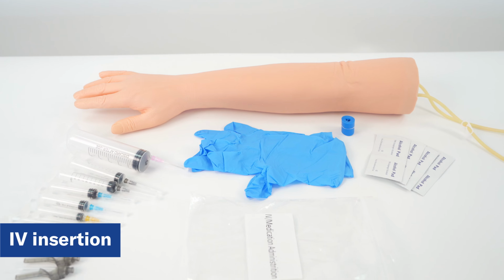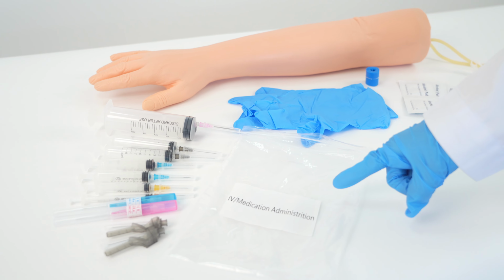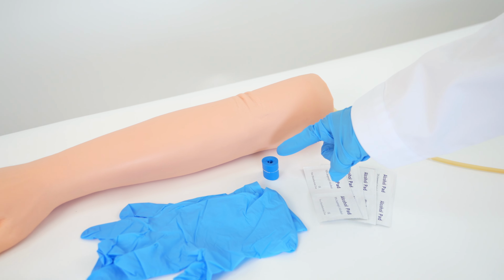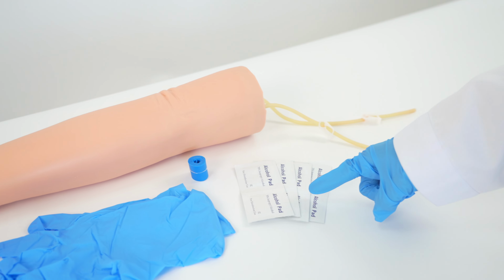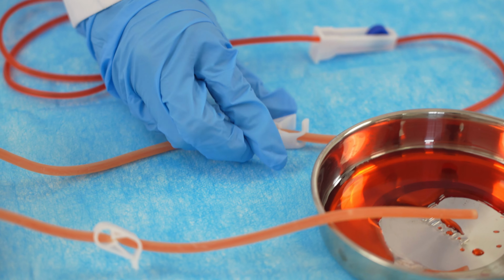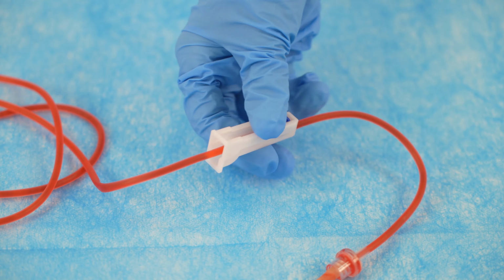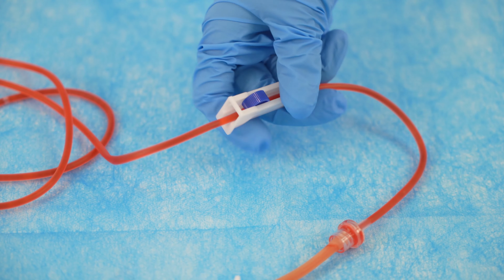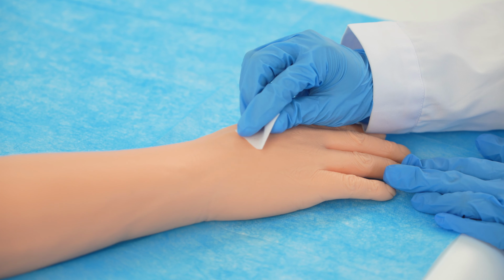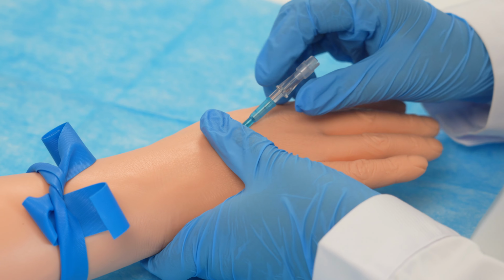Let's begin with IV insertion. Here are the tools you will need: IV medication administration bag, gloves, tourniquets, alcohol pads. Now, adjust the arm by loosening the clamp on the vein area to allow for better positioning. Once set, make sure to open the IV line clamp on the arm and proceed with inserting the IV catheter as you would in a real-life scenario. Practice your insertion technique following proper procedure of IV insertion.